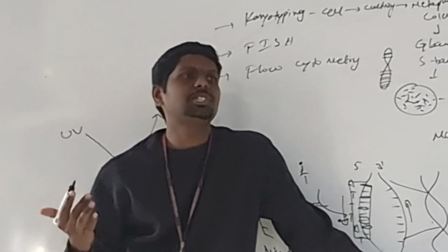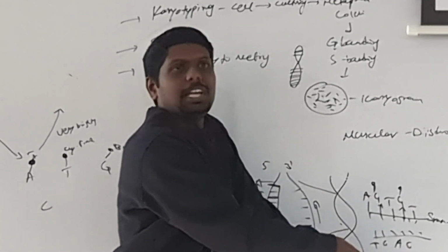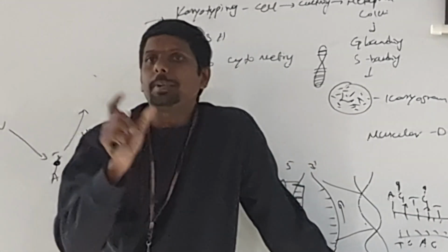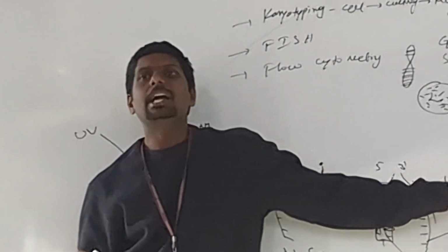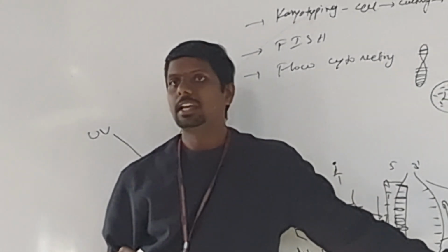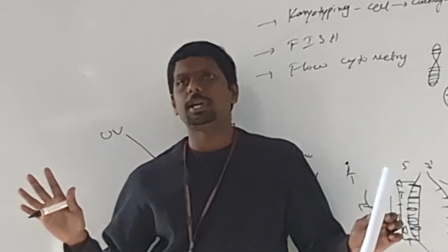That's it. This is FISH. This is called hybridization. Hybridizing a primer to the pre-existing DNA with the help of a fluorophore tagged primer. With the help of the fluorophore tagged primer, we are hybridizing this synthetic primer with the DNA to check whether they will bind or not. Binding is hybridization, no binding, no hybridization.